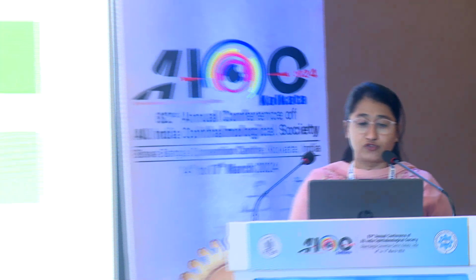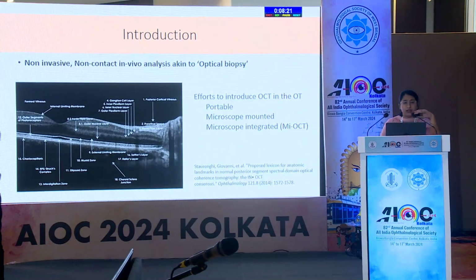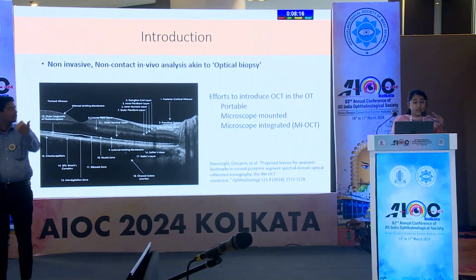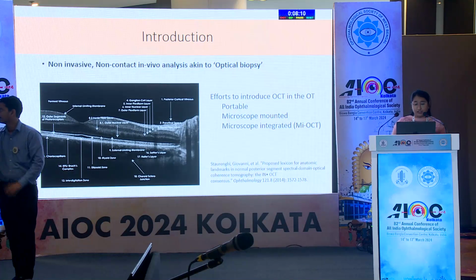So my session outline will be under the following heading. I'm going to introduce you to it, discuss the utility, and then move on to a case-based discussion. As we know, in our clinical practice, OCT has become quite important. It's a non-invasive, non-contact test, and it provides us with basically an optical biopsy of the retinal tissue.